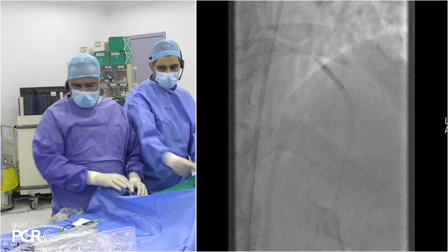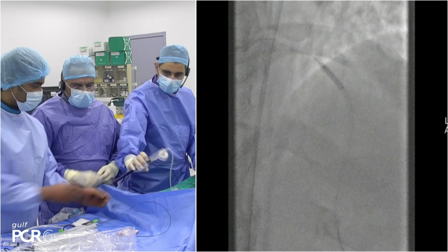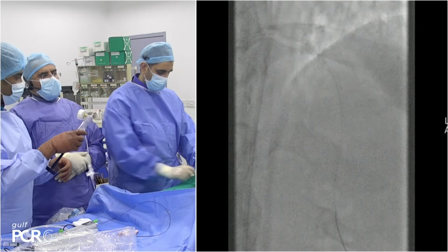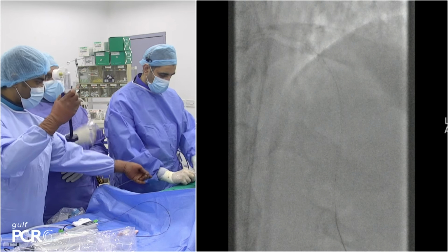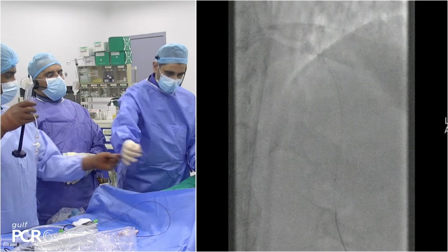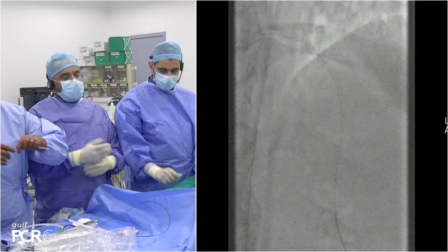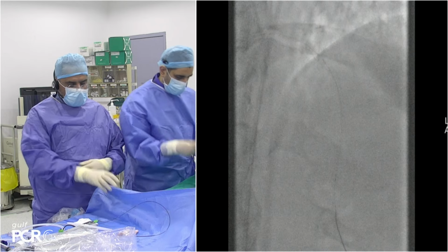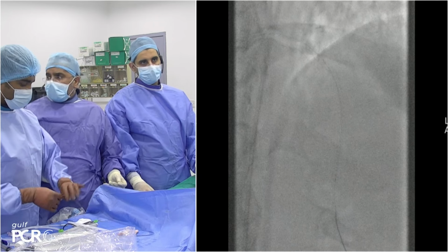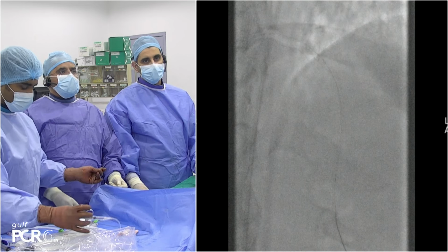There's a question about the stent you've used, Khalid. Which stent size and diameter? Yes, we have used a Xience SkyPoint, which is basically a 2.5 stent you can go up to 3.75 with, and it has a tapered tip, good deliverability, and this is the newer version of the Xience series. Okay, let's go to the OCT, guys. With this 2.5 stent, we can go up to 3.7 proximally if needed.